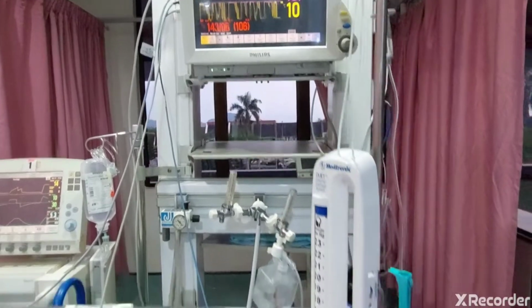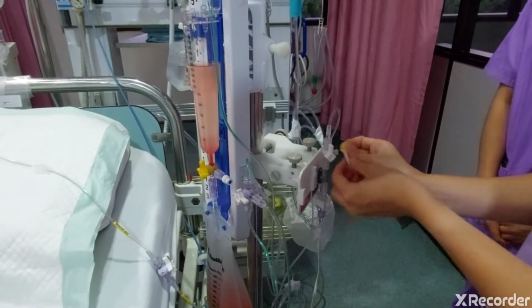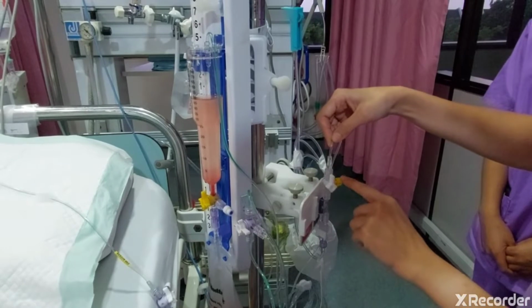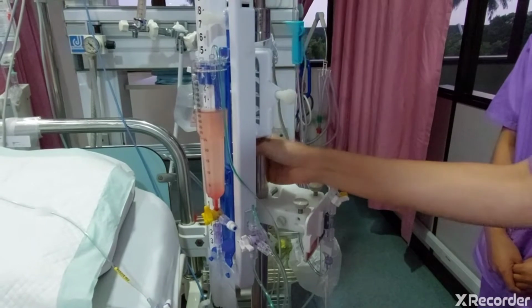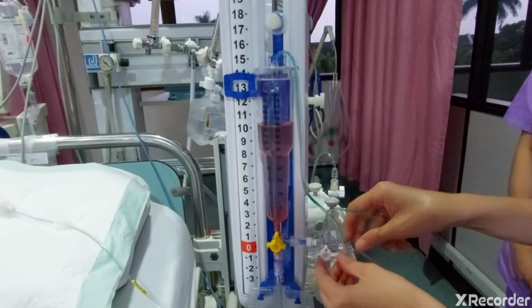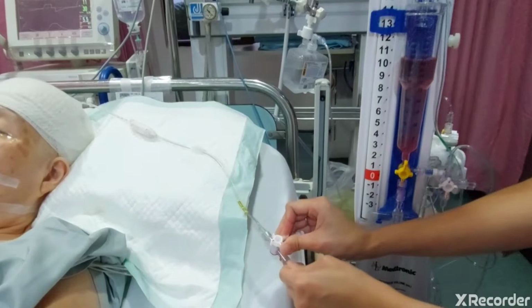Now we need to put this back. We must use the alcohol swab to swab the opening to prevent any infection. After swabbing, okay, this one indicates patient and this one is atmosphere. So we close to atmosphere and open to the patient. Then this tubing is connected to the drainage system like that. This one is the drainage, so close to drainage, open to monitoring. This one is also open to the patient.